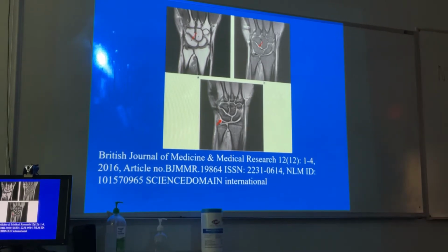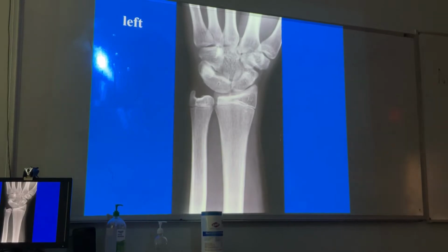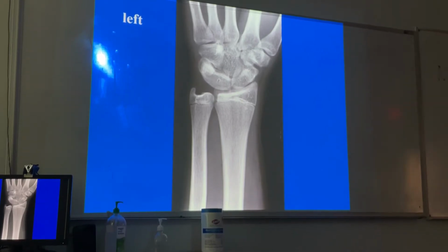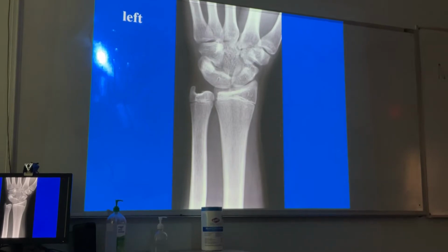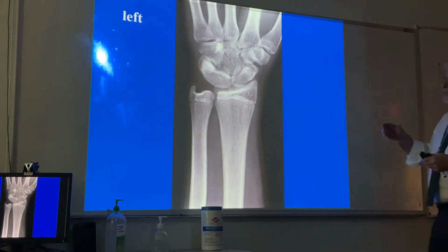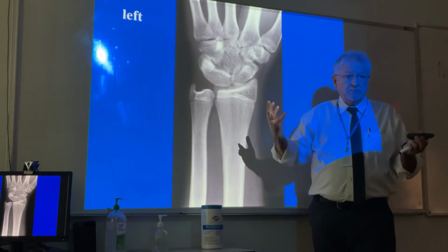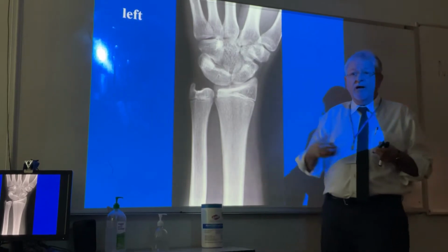So this patient was born with this. Okay? Now, you know me, what does this mean to you, the clinician to be? It's a normal variant, but should this particular individual be a chiropractor? No. Would have pain. Probably not, okay? But what if they're a left-hand dominant electrician? Is their proximal carpal row going to behave the same way as yours and mine? No. Okay? So first thing is what kind of view is it and the recognition of the abnormality.